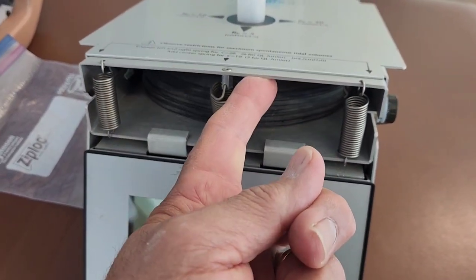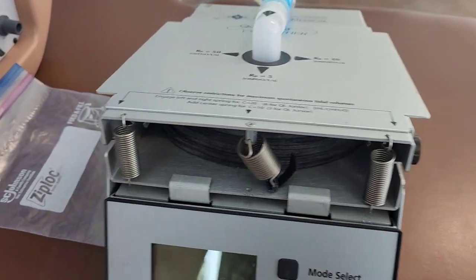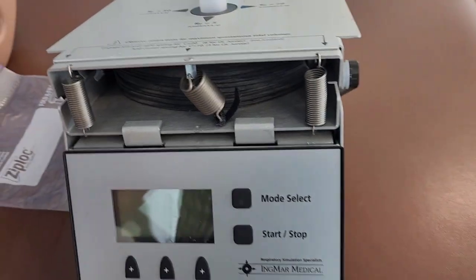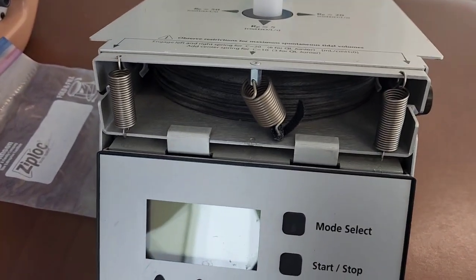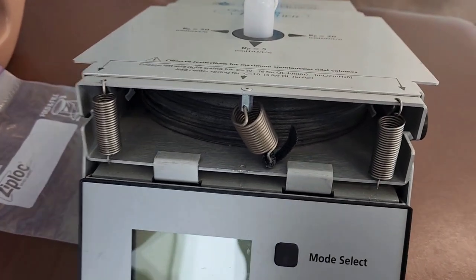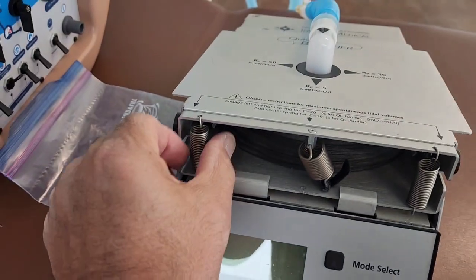So now it's a little bit stiffer. I'll tell you right now, if you add this big spring on there, you're going to have problems trying to read or even try to get a plateau pressure because it's too stiff. I would recommend just doing these 2 springs on the outside, and you will see the difference.